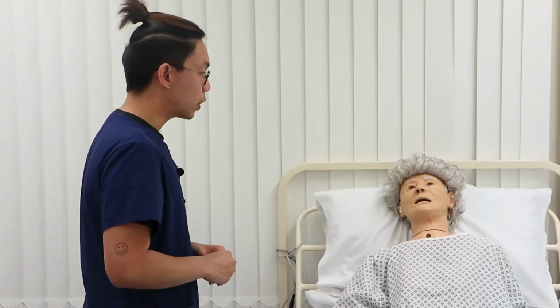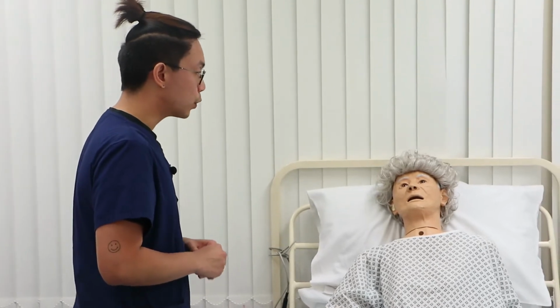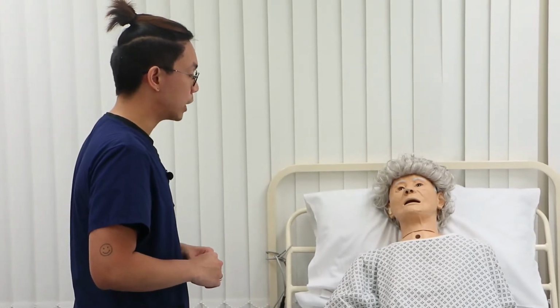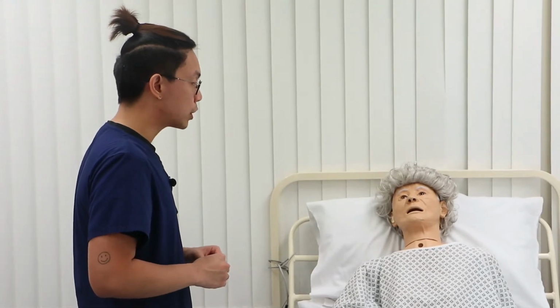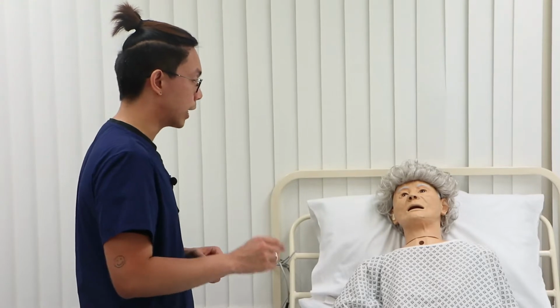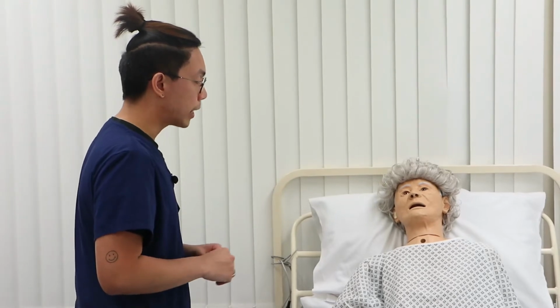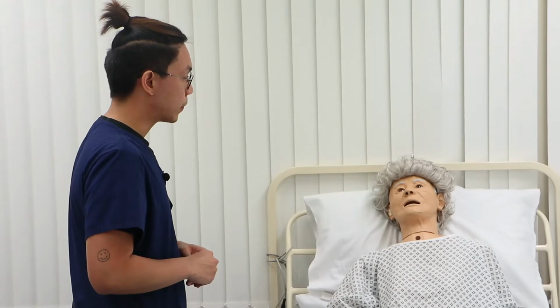bottle. And what you should do is catch your urine in a midstream manner. So for you to do that, once you are already seated on the toilet, and once you've started voiding or urinating, you could probably count 1 to 3 seconds. Once you've reached the 4, 5, and 6 seconds, you could use the cup I'm going to give you and catch the urine in the middle part up until you've filled the specimen bottle or the cup that I'm going to provide you. And the rest of your urine, you can void in the toilet. Is that clear with you?